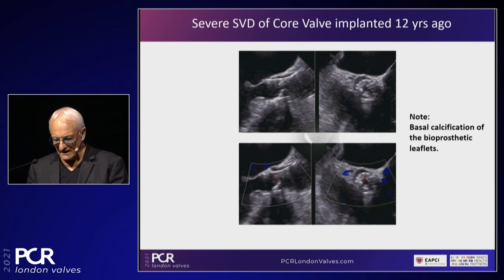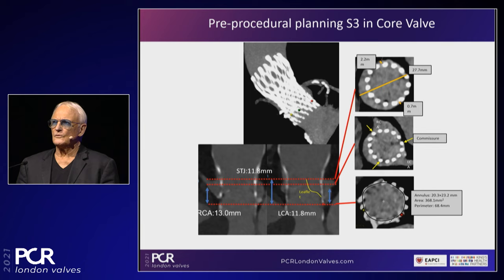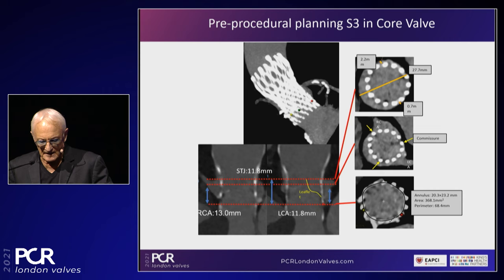And I admit here that there was a long discussion with Jeff in this particular case, not as chief medical officer of Medtronic, but as a colleague, a long-standing colleague and friend. We have done many cases together, and we discussed this case at length. And basically, we decided to put the Sapien in there with all the pre-procedural planning, particularly reserving coronary access. And as you can see here on the lower part, there's a little bit of a critical situation with the coronaries. It is not exactly the cutoff at 10, it's 11, but close enough to pay attention to it.